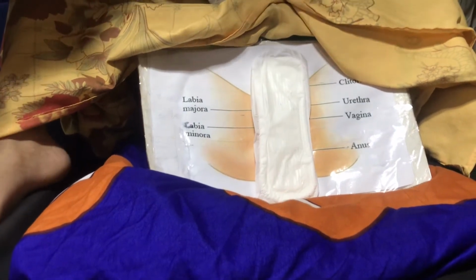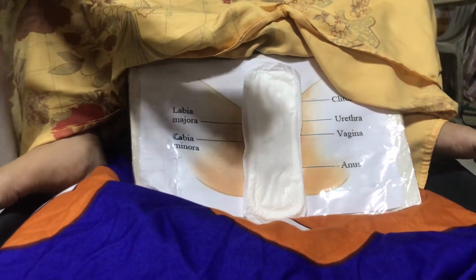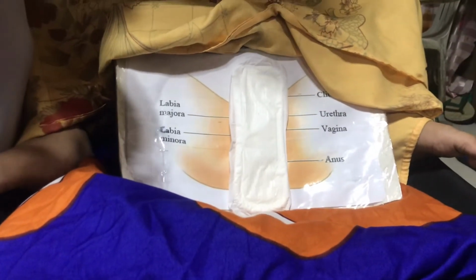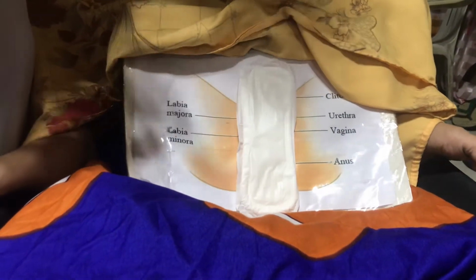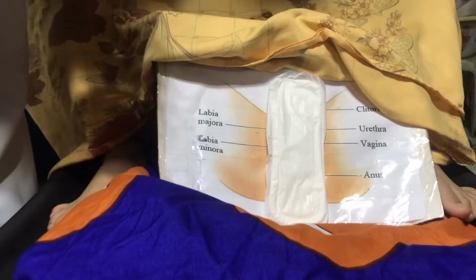After the care of the materials used, remove and discard the gloves and perform hand hygiene. Then record the treatment done to the patient and any unusual findings such as redness, excoriation, skin breakdown, discharge, or any drainage, and any localized areas of tenderness. The rationale for this is for documentation purposes.